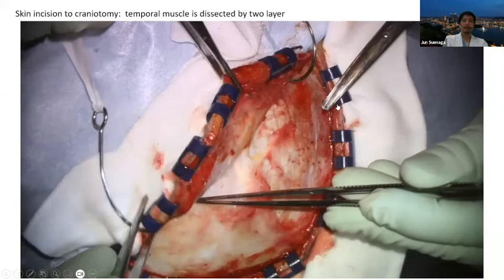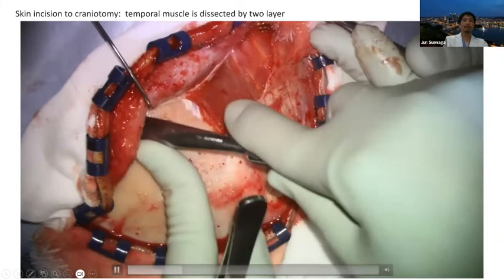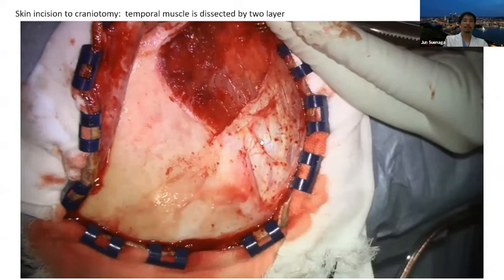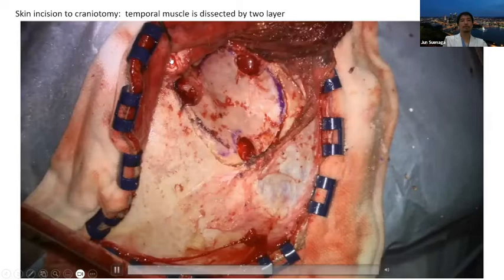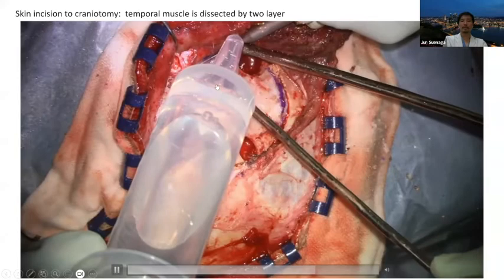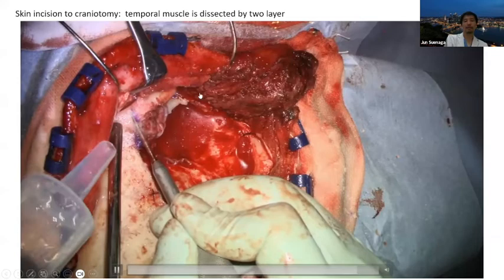This is my typical skin incision and craniotomy method. I use a two-layer method of temporal muscle dissection to preserve the temporal muscle fascia and periosteum, and open the craniotomy according to the tumor location. If the tumor is lateral, a smaller area is sufficient. If the tumor is upper, medial craniotomy is essential. Using a chisel, the sphenoidal bone ridge is removed and a gutter is made to the orbital rim.